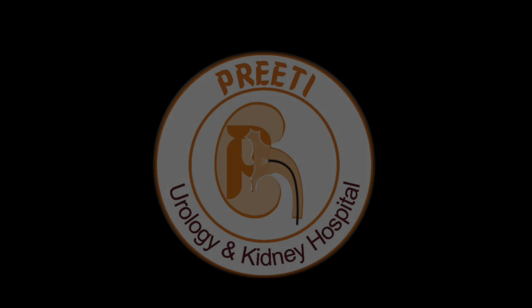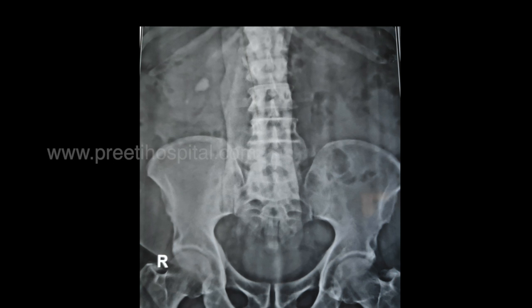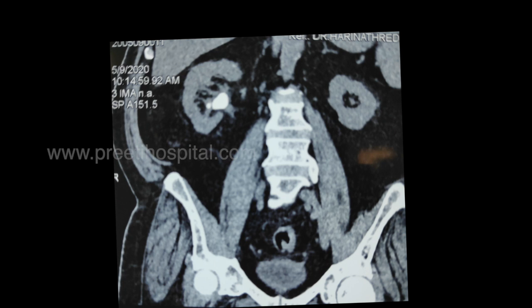Here is a case of a large stone volume where RIRS can be done in a shorter time using 60-watt Thulium fiber laser. The patient underwent PCNL unsuccessfully — the stone could not be removed six months back. The infundibular length is narrow and not dilated; multiple calices and infundibulae are present. The CT shows clearly non-dilated infundibulae with fat around.